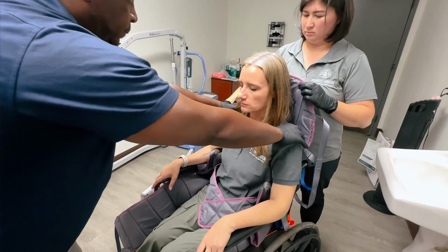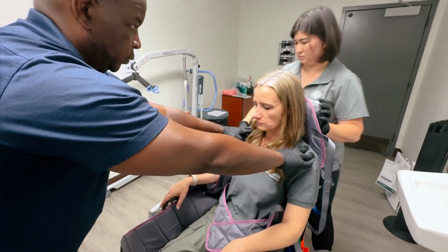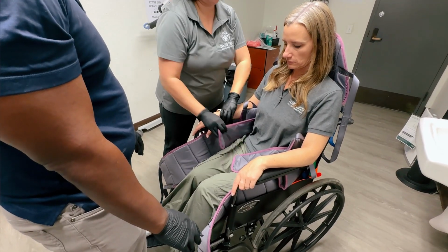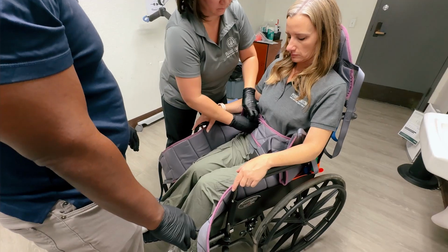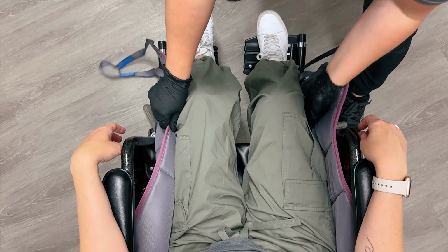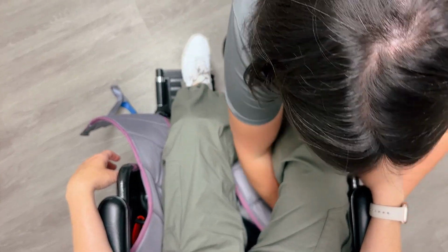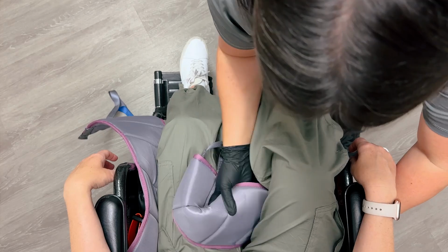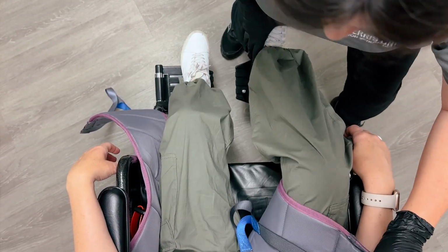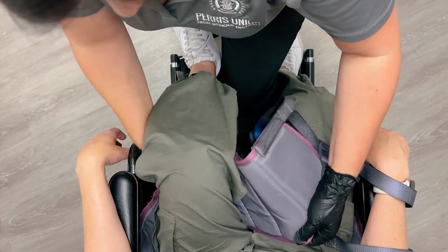Lean the student back into the wheelchair with the assistant in back supporting his or her weight. Toileting slings have a waist buckle which helps hold the sling in place during positioning. Fasten the buckle and tighten the strap around their torso. Bring the leg straps forward and under the leg, lifting each knee to get the straps up high under the thigh. This is the key to a safe, comfortable transfer.